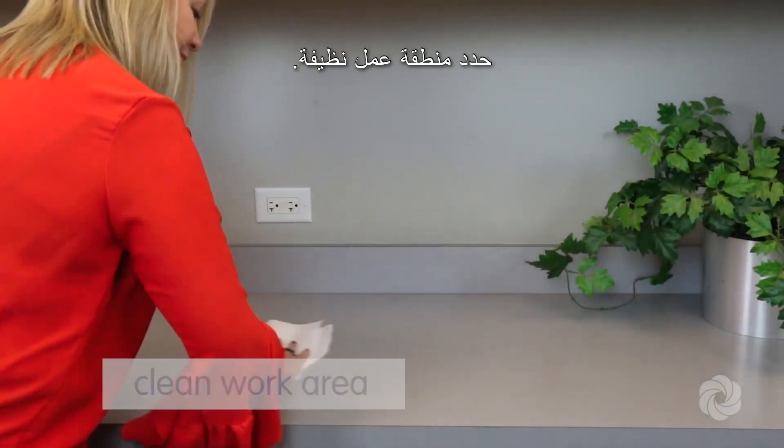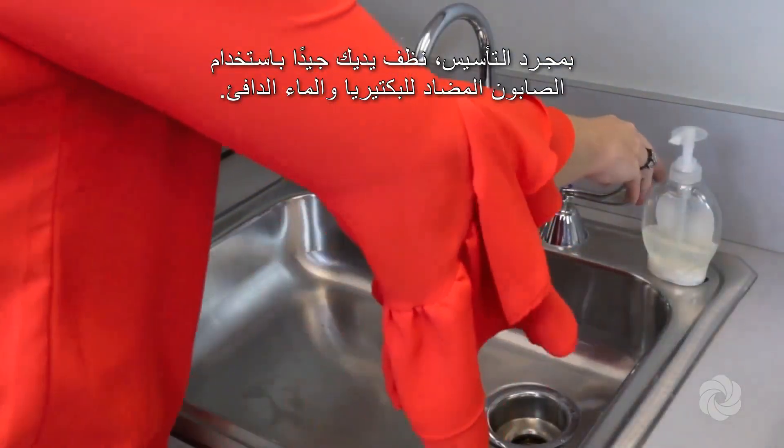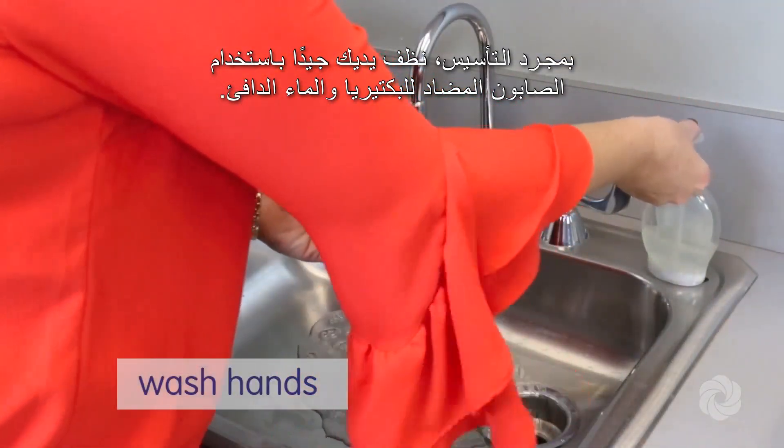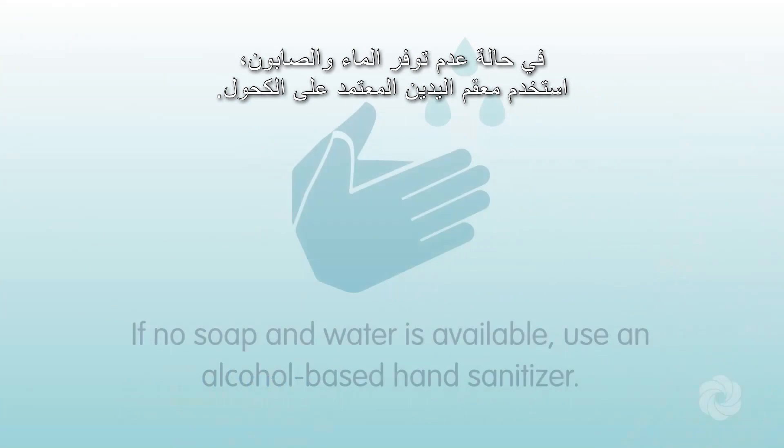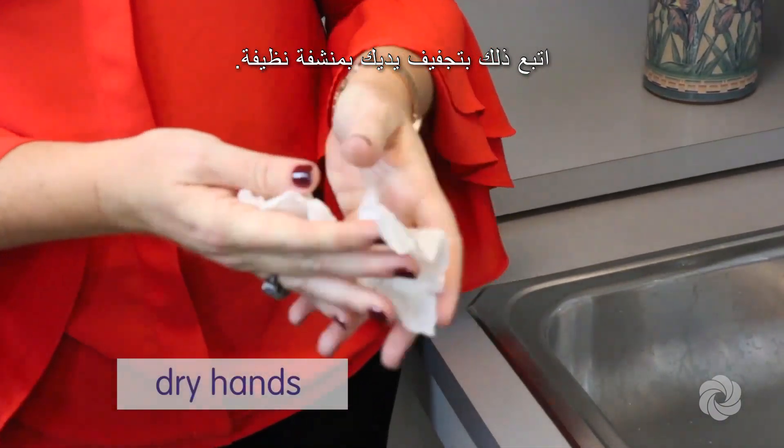Select a clean work area. Once established, clean your hands thoroughly using antibacterial soap and warm water. If no soap and water is available, use an alcohol-based hand sanitizer, followed by drying your hands with a clean towel.